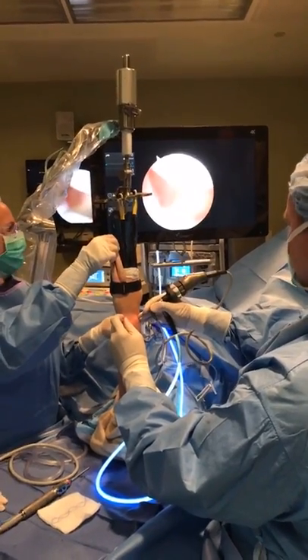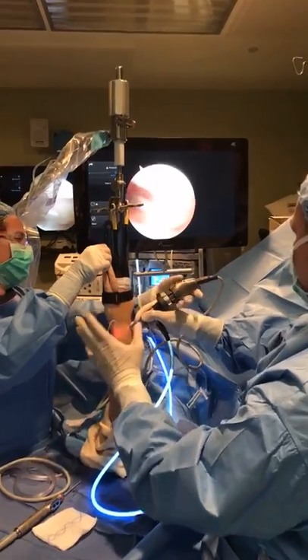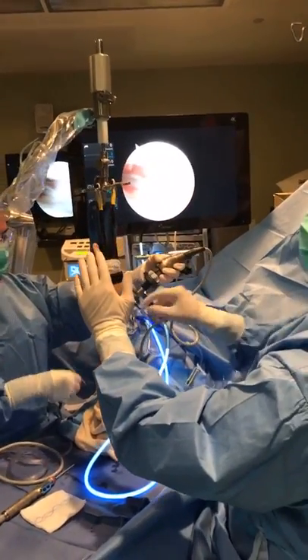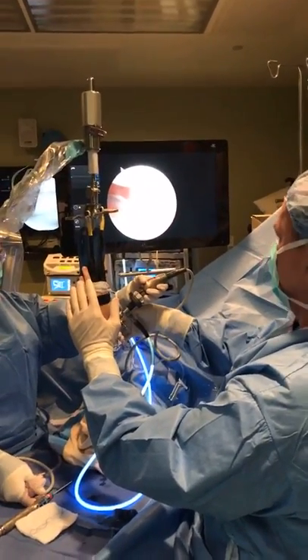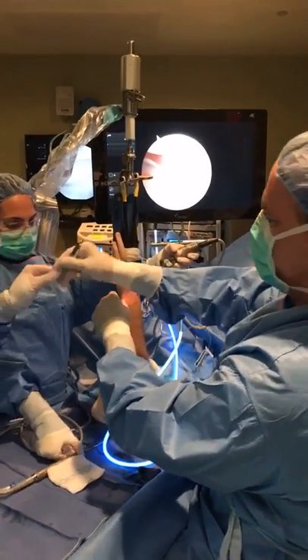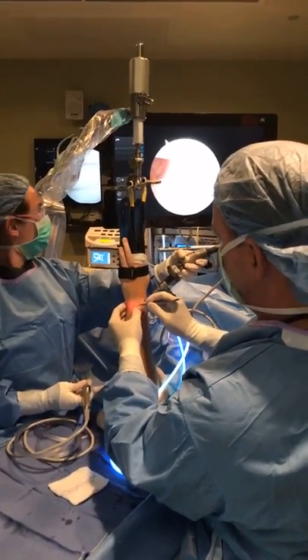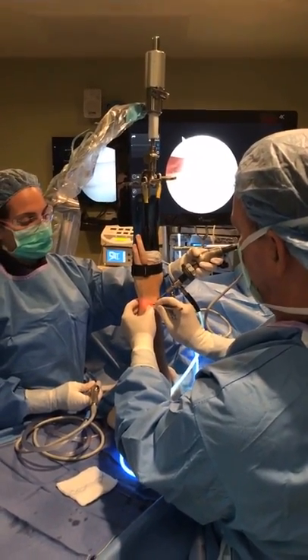And so now you're gonna see that this needle is gonna go in there. There it is, okay? So now it's shooting out. You can almost hit the camera. So I'm gonna turn down the pressure. So we're in the diagnostic component right now, right? I mean, we're not fixing anything yet. We're figuring out what's causing this guy's wrist pain.